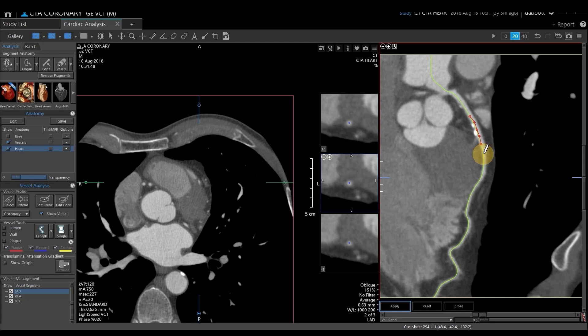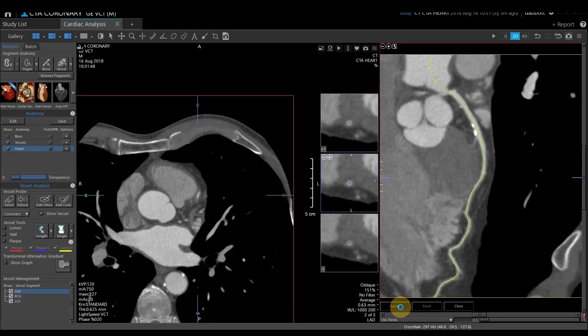I can put as many points as I want. If I need to fine-tune a point, I can hover over one, then left-click and drag. I want to make sure it's not touching that calcification and that my point is going down the center of the vessel lumen. When I'm happy with my point placement, I'll come down to the bottom and select Apply. That's going to edit that line.